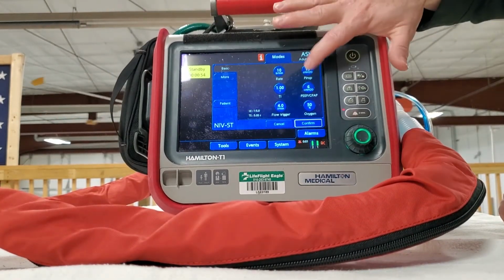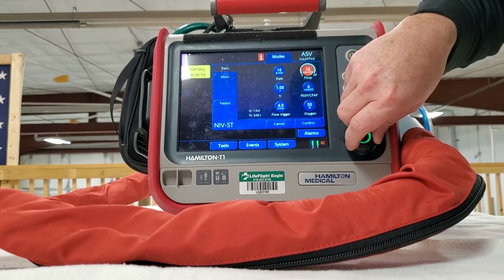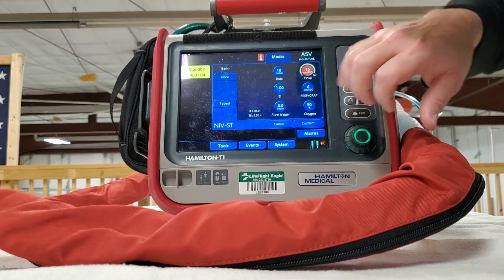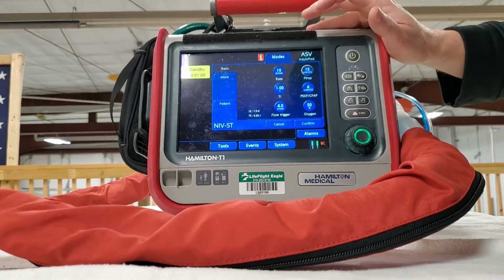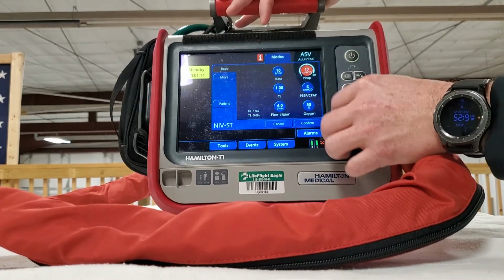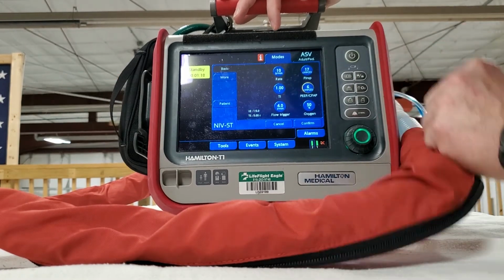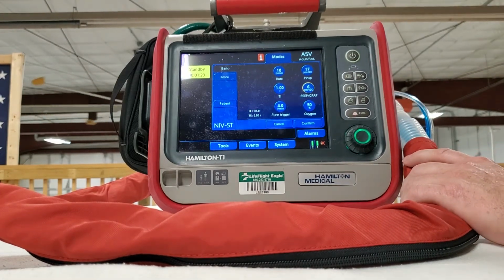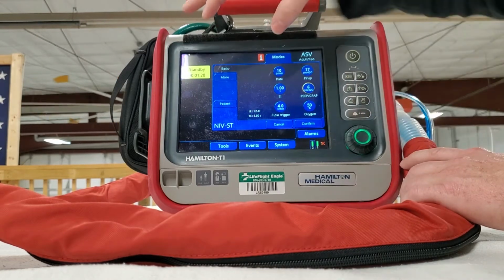This is the backup rate, so P-insp is the same as pressure support in our CPAP mode on the ZOLL. Basically all P-inspiratory does is set the amount of pressure being delivered in the inspiratory phase to assist them with breathing. So if they're having trouble breathing, can't get enough air, you just turn that up. PEEP and CPAP, PEEP is PEEP. It's what we use to try to improve oxygenation. Excuse me, hold everything open. Oxygen, FiO2, flow trigger we talked a little bit about.